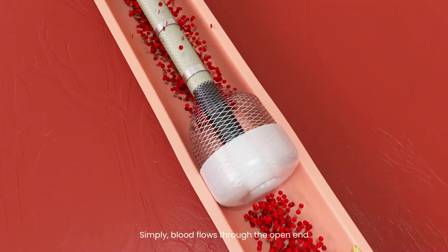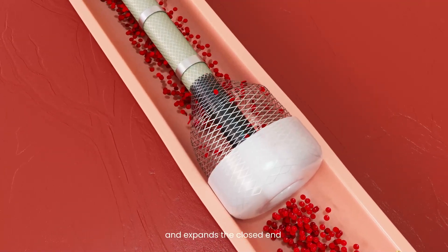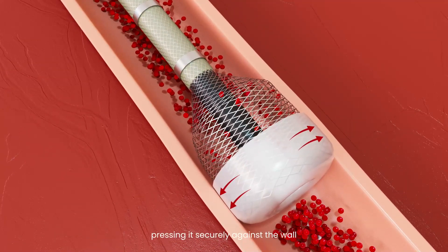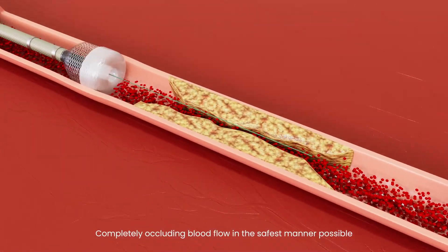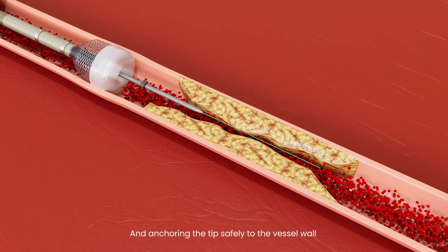Simply, blood flows through the open end and expands the closed end, pressing it securely against the wall, completely occluding blood flow in the safest manner possible, and anchoring the tip safely to the vessel wall.